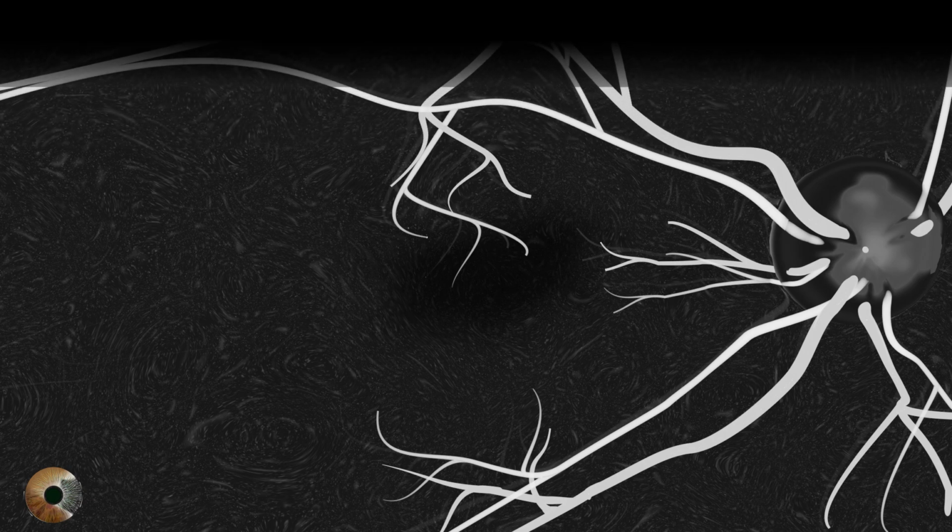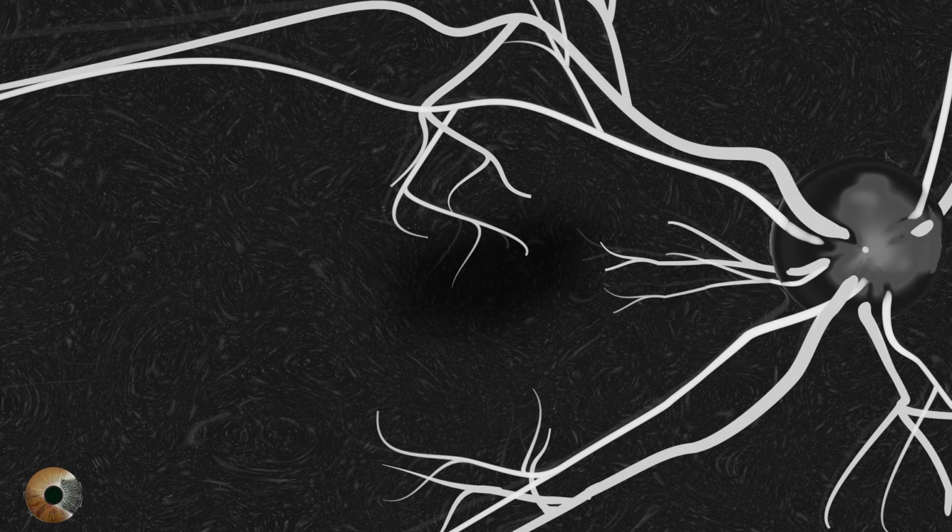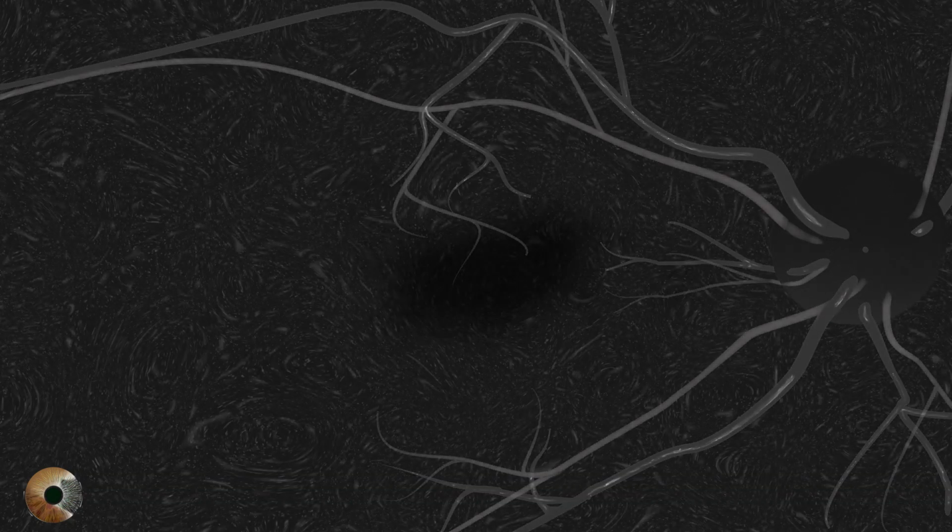The dye then will re-enter the same circulation over and over with dilution of the fluorescence until it completely disappears from the eye circulation after 10 minutes of injection. This phase is called the recirculation phase.